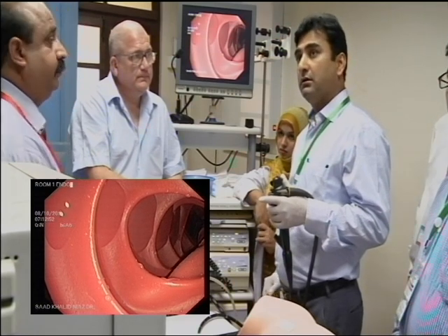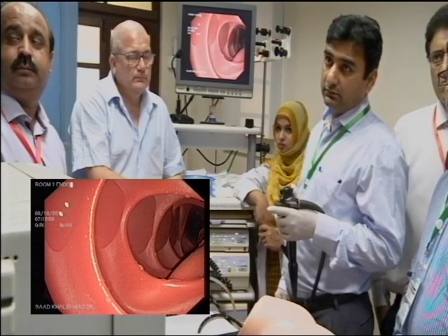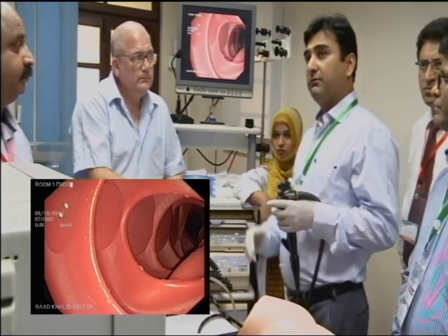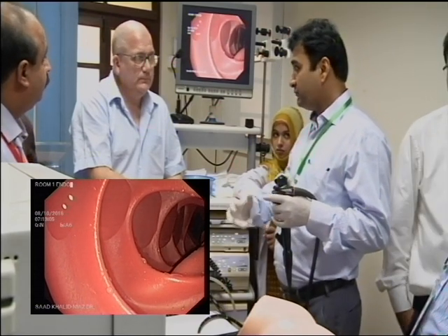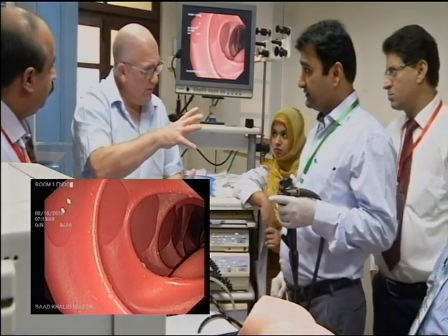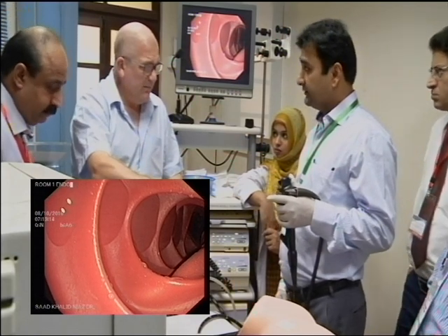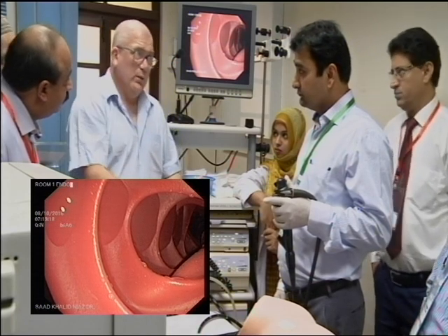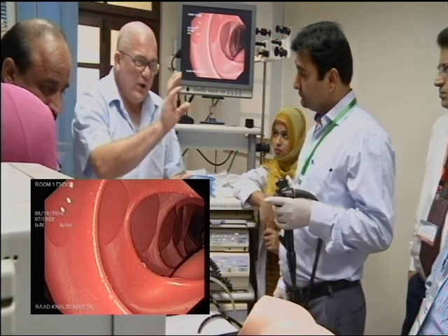When you withdrew the scope and relaxed everything, what do you think happened? I had a better view of the lumen. Why? Because previously my scope was much more rigid. You gripped the scope and it made it rigid. That's one. Two, you were throwing everything at it. Three, you were running. You weren't walking. You weren't strolling. Right. So, we got him to slow down.